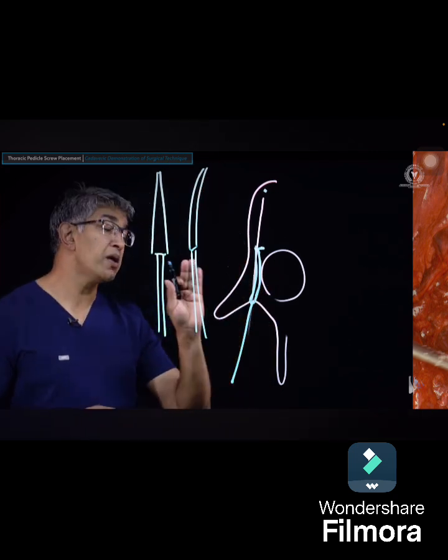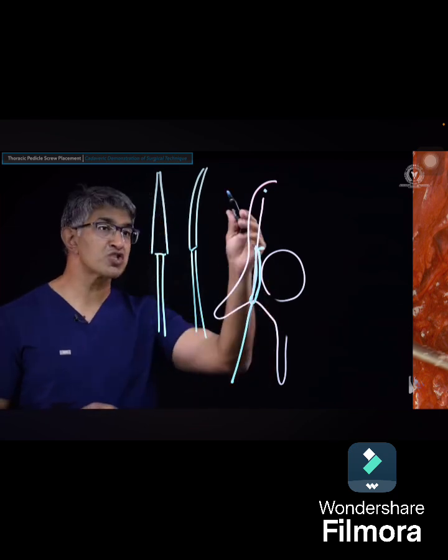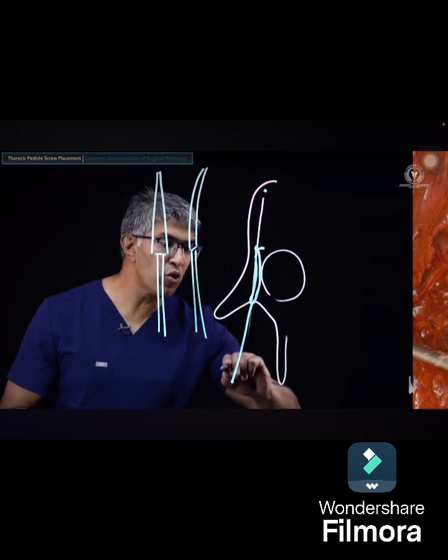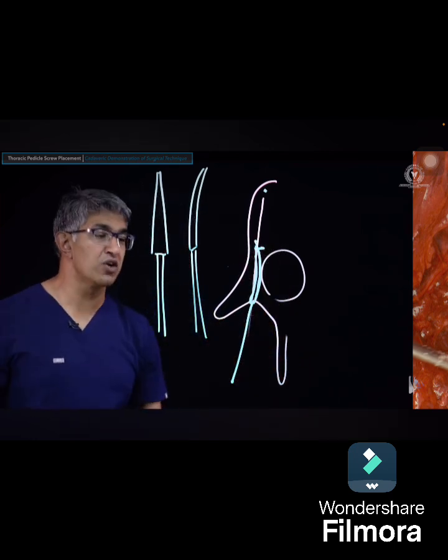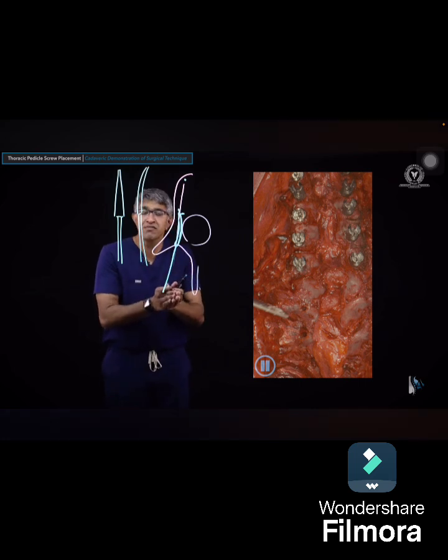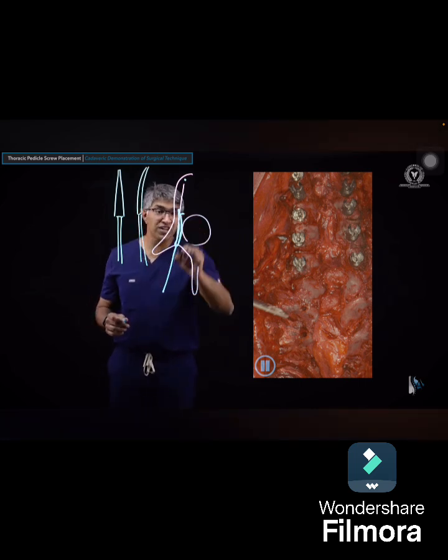That is going to be directed medially, and that's because you want this surface to brush off the cortical margin of the pedicle. So what you generally do when you put this in is exert a bit more medialization, to feel it almost come off the surface here. So you'll medialize it a bit more with the bevel medial. That's counterintuitive because in the very superficial portion of the thoracic pedicle, you generally don't over-medialize. But with a curved gear shift, that's how you start it.